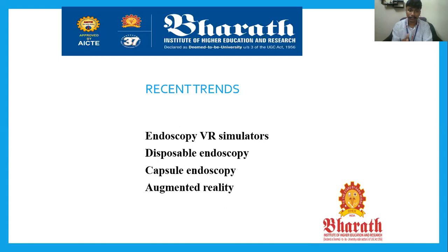What is the advantage of capsule endoscopy? No need of sedation, no need of insertion of wire. Without sedation and insertion of wire, all internal organs are captured by the capsule endoscopy. This is the real benefit to the patient. They don't have any complexity while the endoscopy is captured in real time.